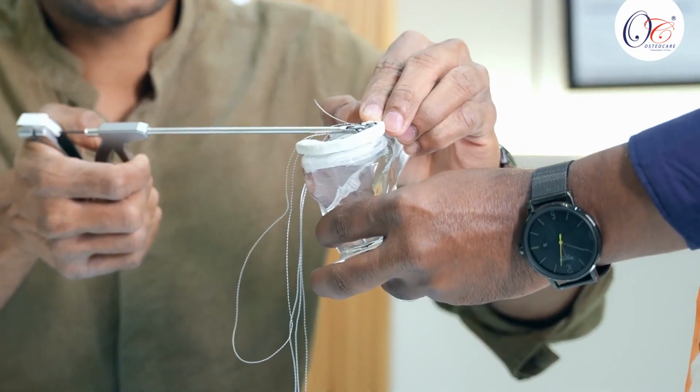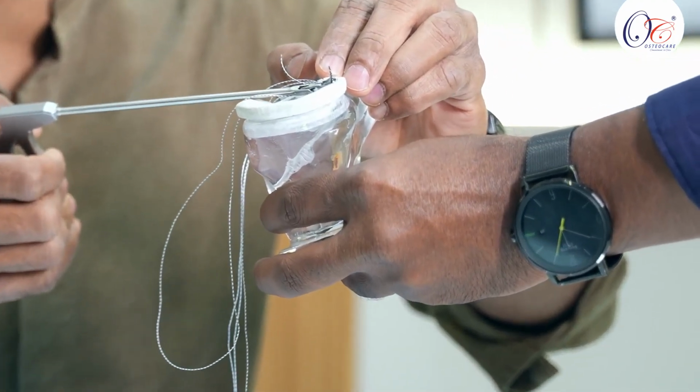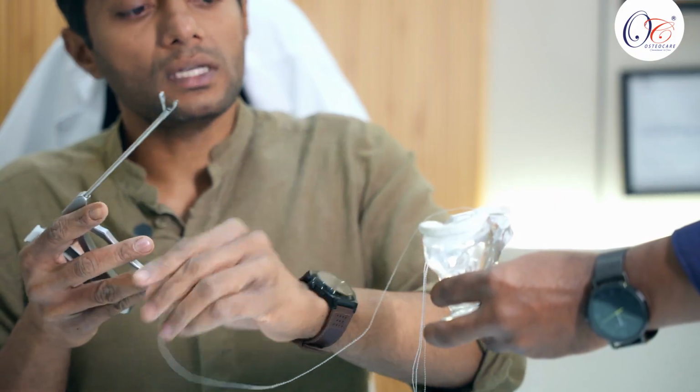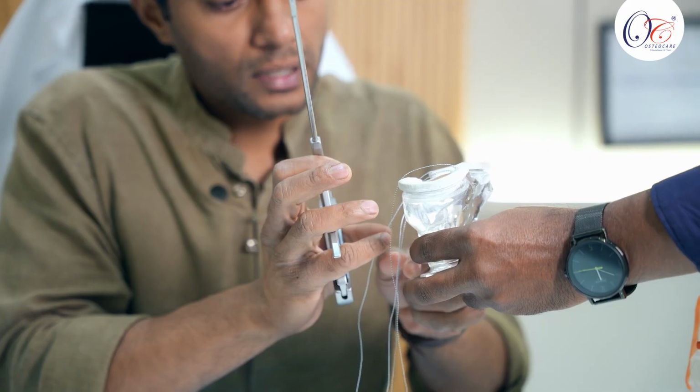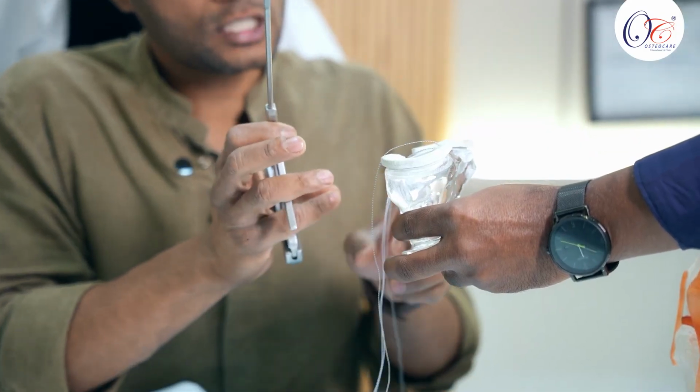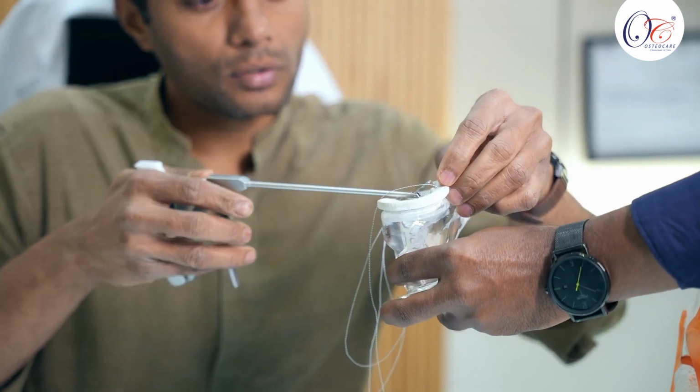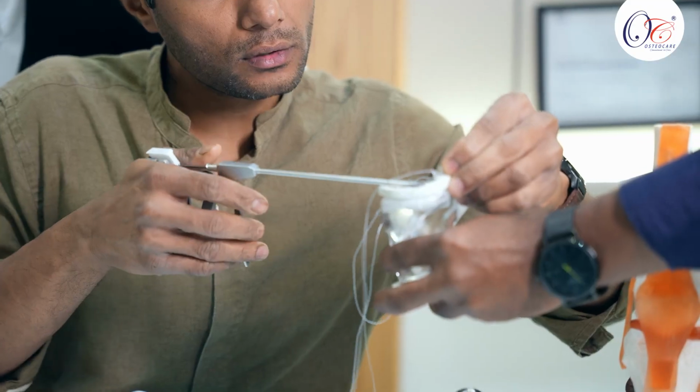We can clearly see that this is a direct suture passer which can bring the suture material outside in this way. So we try to pair it in the form of a modified Mason-Allen stitch pattern so that the pulling strength will be much higher. So number 2 goes in and number 3 goes in.